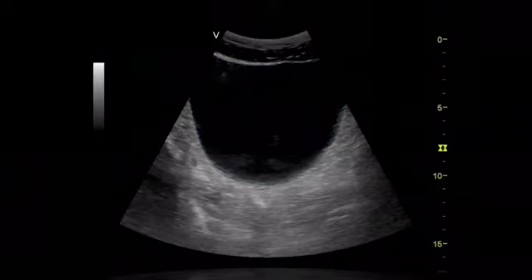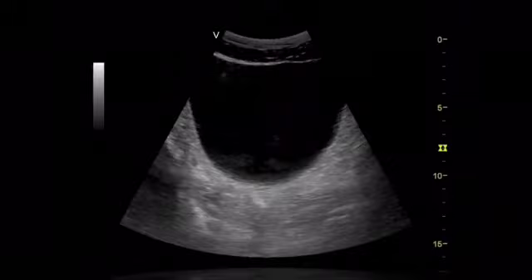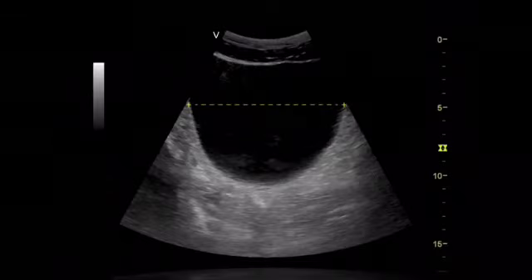Obtain a mid-transverse image where the width of the bladder appears to be at a maximum. The bladder wall should be smooth with no mass protruding into the lumen of the bladder. Measure and document the transverse dimension.